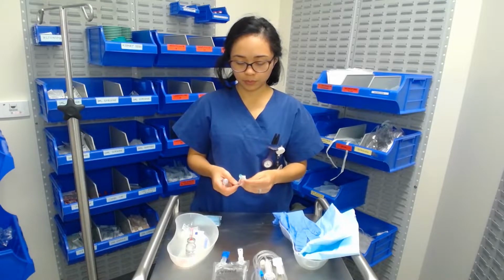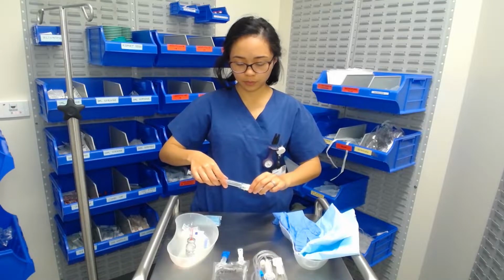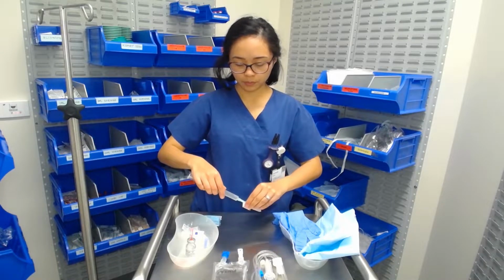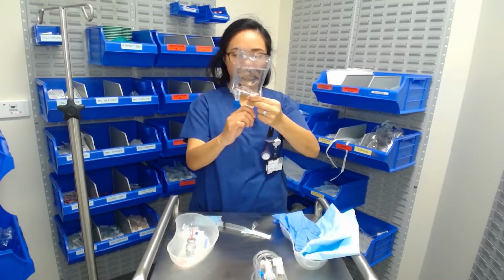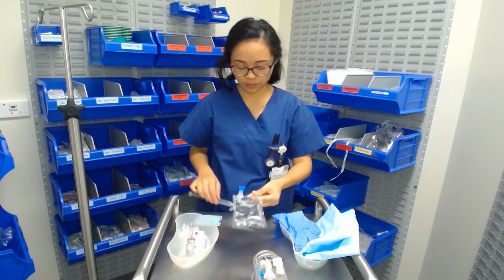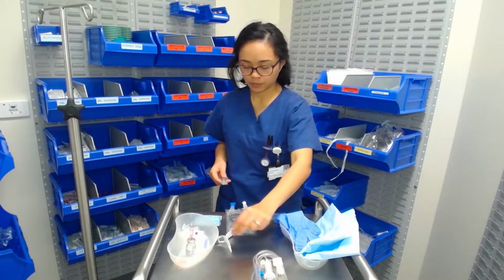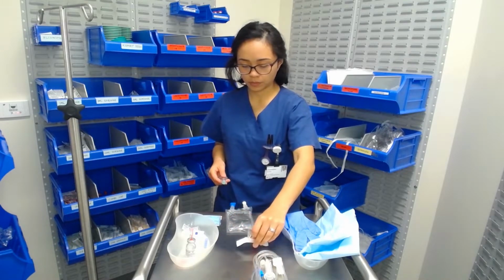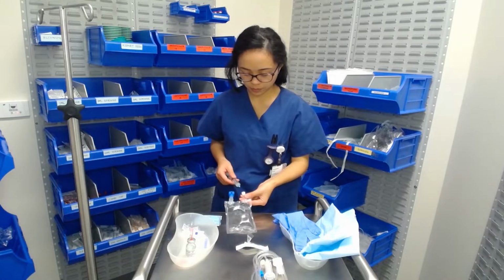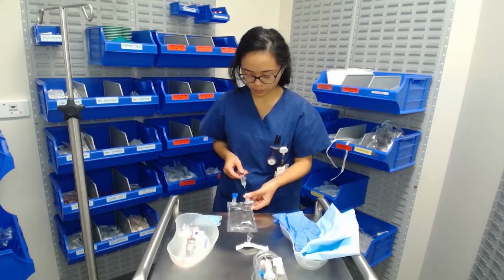I'm adding the solution to the bag, so this requires me to locate the medication injection port. On this bag, it is white and indicated by an upward arrow. This particular brand or manufacturer of this IV medication bag keeps a cap on the end which you have to flick off. The medication injection port inside is self-sealing to prevent introduction of microorganisms after repeated use.